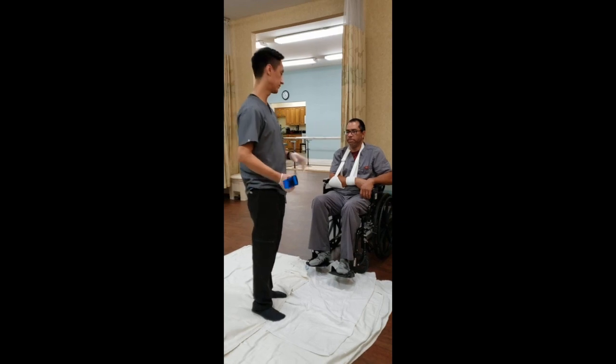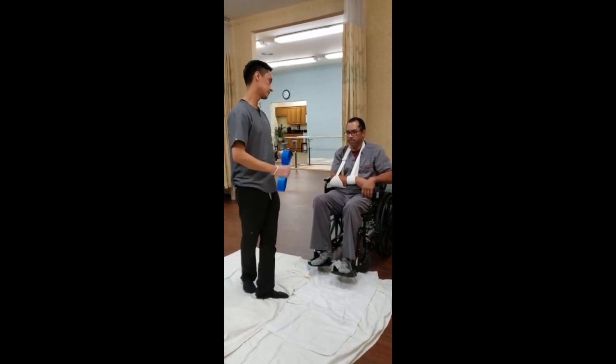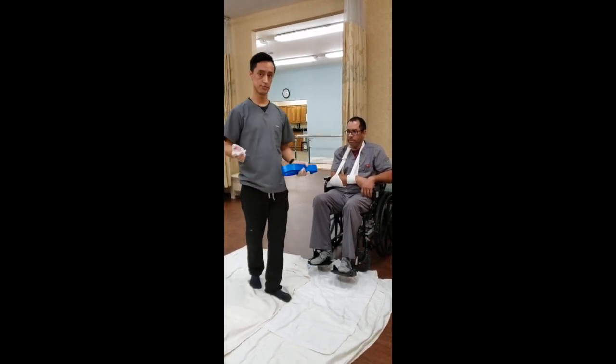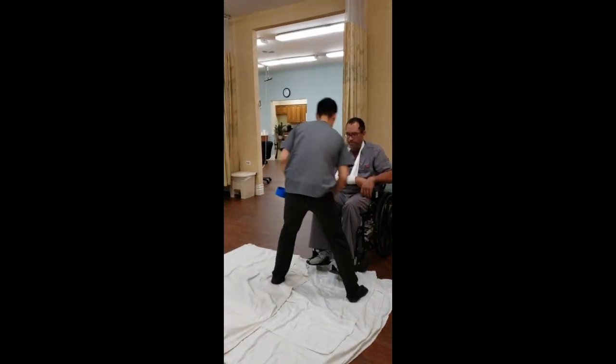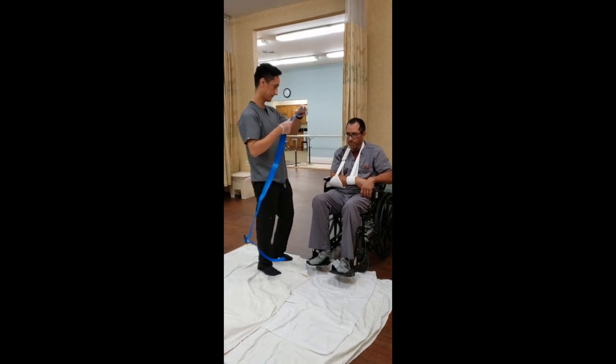How to do a transfer going from the wheelchair to the floor on a CVA patient. In this case, we're going to assume that the patient's weak side is the right. A few things to consider before doing the transfer is make sure that the wheelchair is locked. Make sure that you put a belt on the patient.